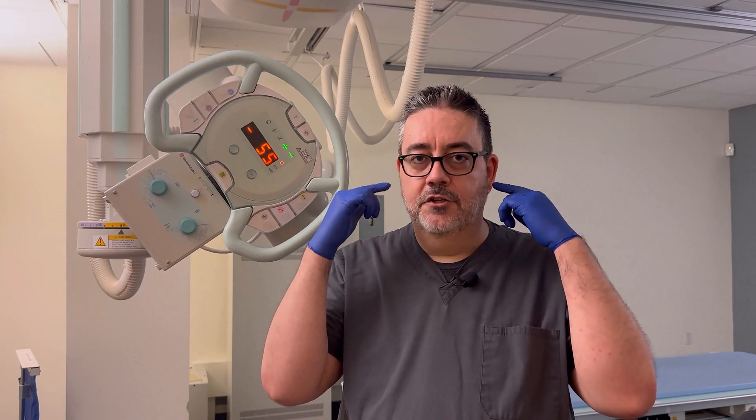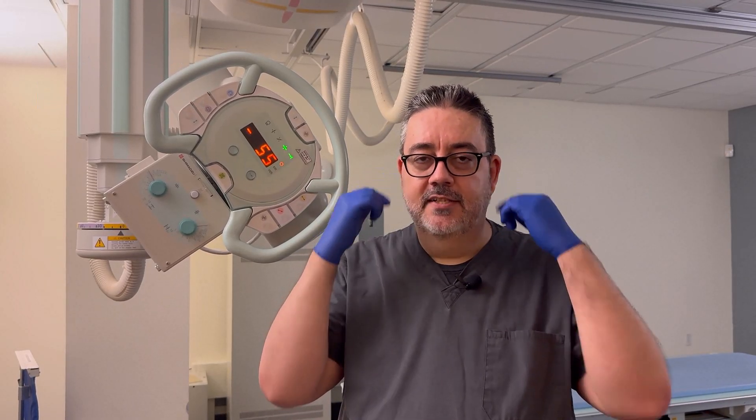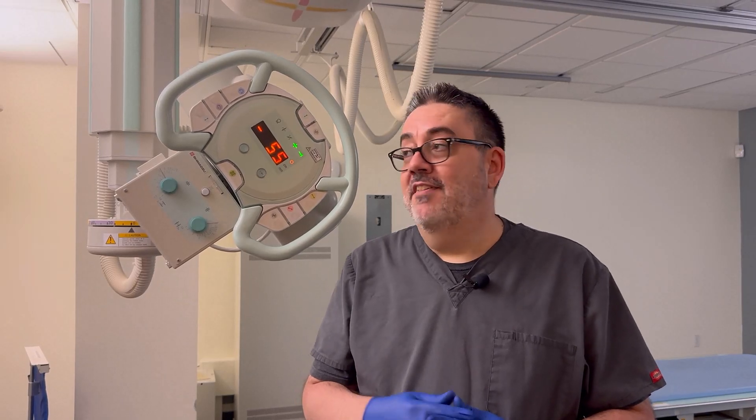We're going to do the Town's view for the TMJs. This is supposed to get the junction between the condyles and the fossa. The only difference is that normally a Town's view for most everything we've been doing is 30 degrees caudal, but now we're going to do a 35-degree angle instead, just to open up that joint space a little bit more.